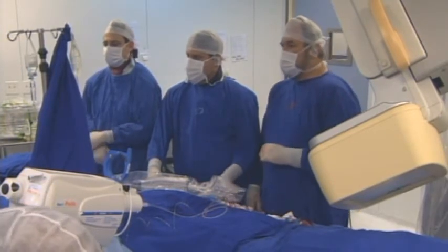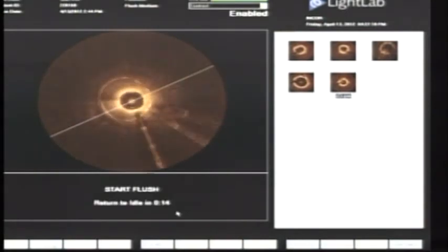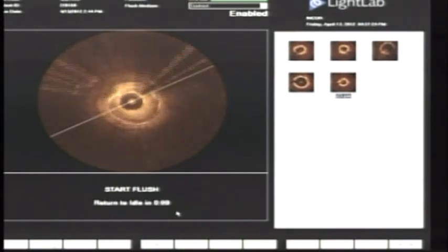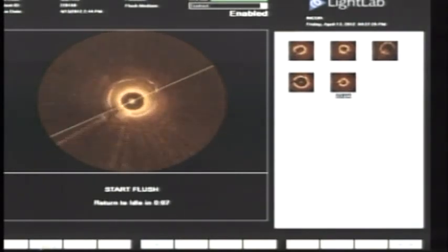And they have a bioabsorbable polymer version as well. So that OCT image was not so helpful. I don't know why. Is that because it was obstructing distally and it was not washed all the way?